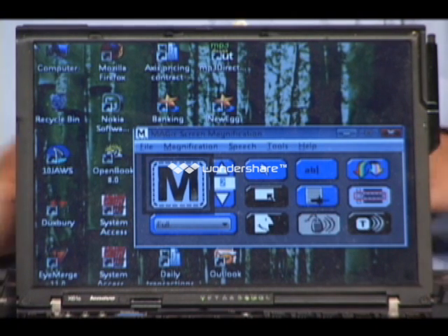But a screen enlarging program can do several things. The question comes up to me sometimes, how come I need this because I can just go into Windows and set up and enlarge things? You certainly can, and there are some features in Windows that allow that. Magic, however, has some features in it which do not exist or are easier to use and give you more flexibility than the Windows enlarging package. Now the default, as I have it set here, and you can change that, is 2. Now, are you looking at the screen now? Yes. Okay.